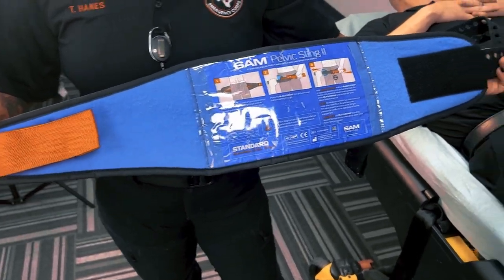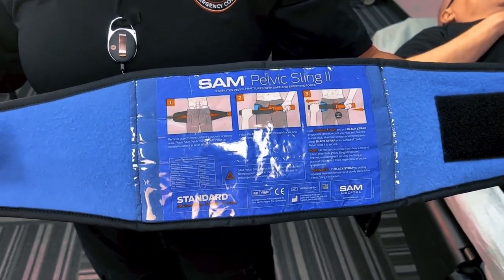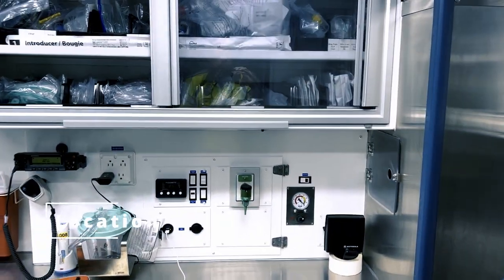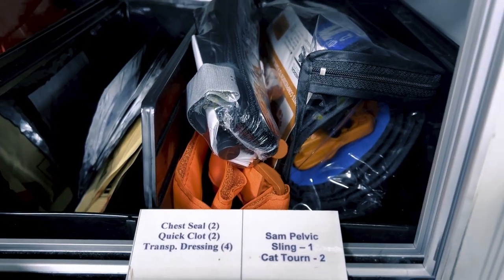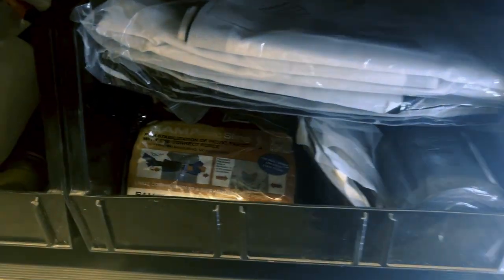To start, you'll need a pelvic binder, which is a wide elastic band that wraps around the pelvis. HCEC ambulances carry at least two pelvic binders — one in the cabinet behind the captain's chair and the other in the outside driver's side compartment.